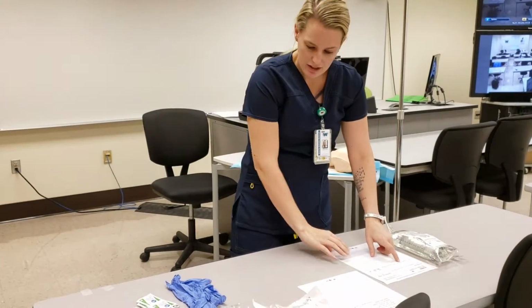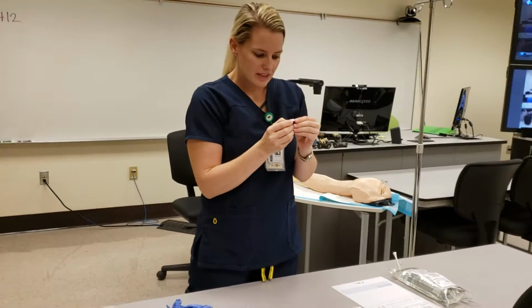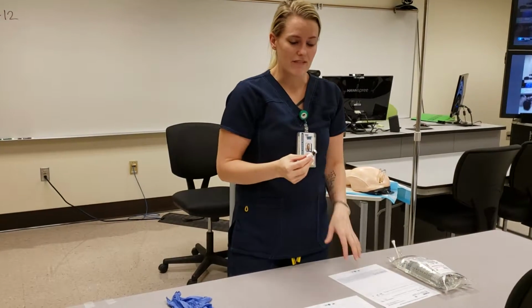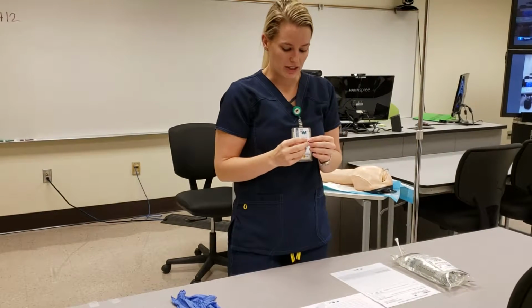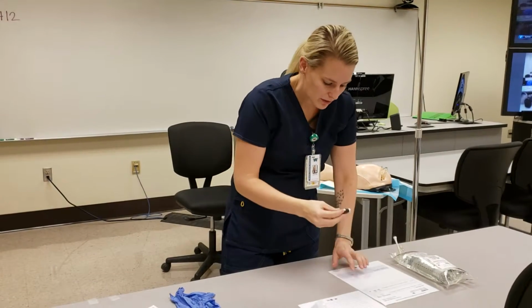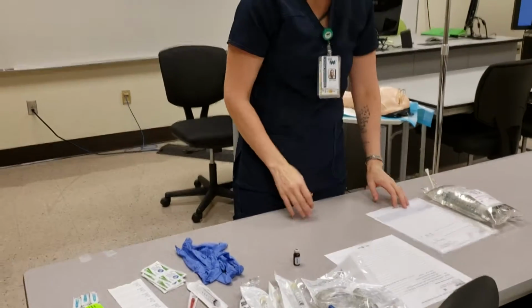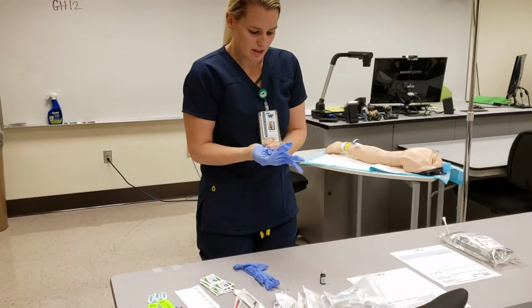And then we have our morphine sulfate. So I have my morphine sulfate here. This is 10 milligrams, and we do need to dilute it. I've already done my math, and I know that I need to draw 0.5 milliliters to dilute into 5 milliliters of normal saline. So I will get that ready, but morphine 10 milligrams per milliliter. So I'll go ahead and get my gloves on and get these ready.